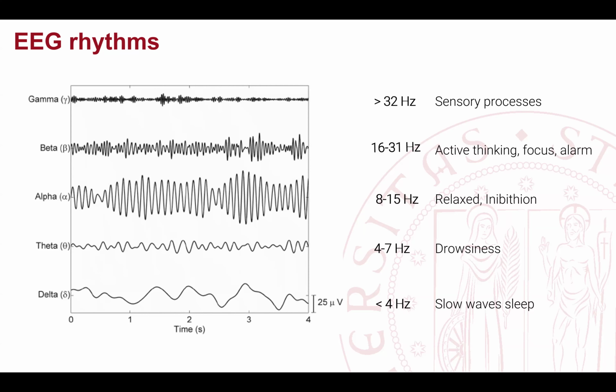Okay, going further with the frequencies, we have other types of bands, which are the beta bands, which is mostly coupled with the alpha bands, and is related to active thinking, but also motion planning, focusing. So it is a similar behavior to the alpha bands, and all of them, we'll see better later, are also called sensory motor rhythms, as they are the EEG rhythms related to the motor activity.